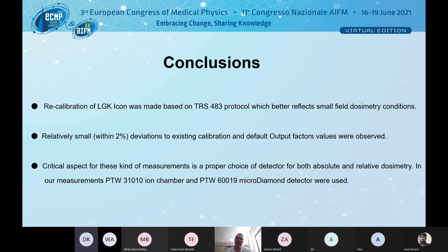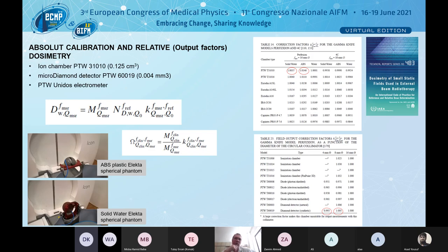which is shown here. So to measure dose rate, you have to use one of those spherical phantoms. I'm using a PTW 31010 chamber, the same electrometer, the PTW Unidos, which is of course calibrated every 2 years as well. And then it's a very standard measurement, using a timer. That's the way it should be done really.